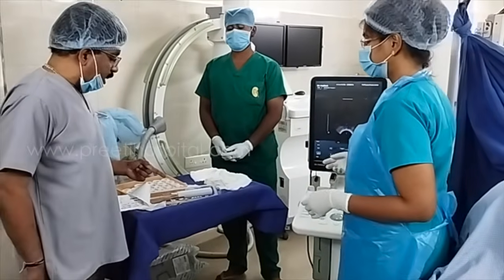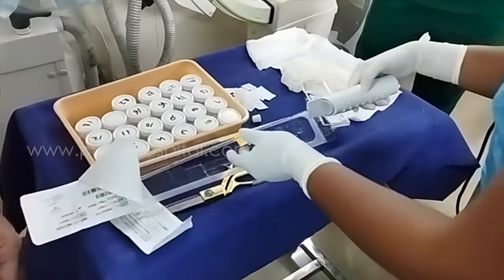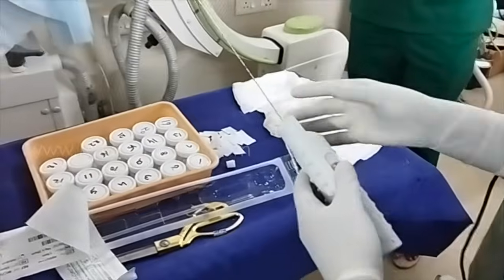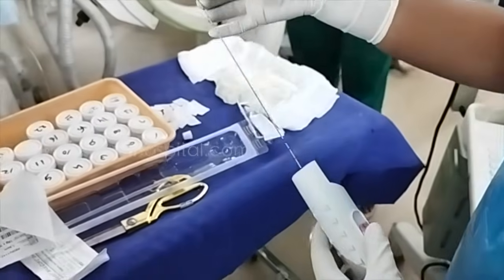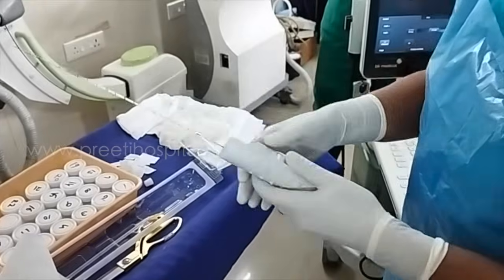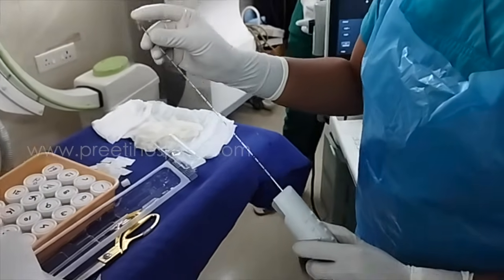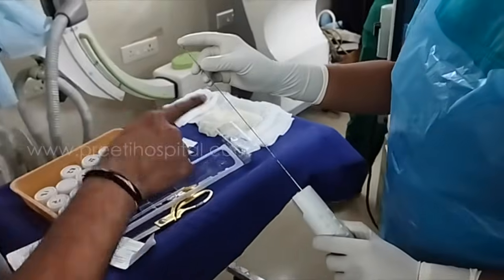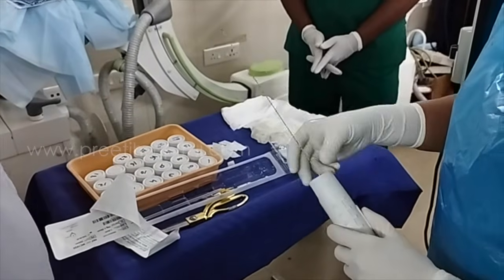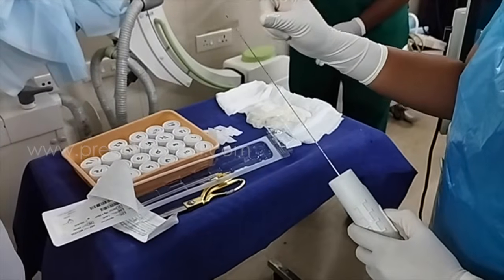What is the routine biopsy needle and biopsy gun which you are using? This is the gun which we use for prostate biopsy. The length of this needle is 22 to 25 centimeters, it is an 18 gauge needle, and the core which comes through this measures about 18 mm.